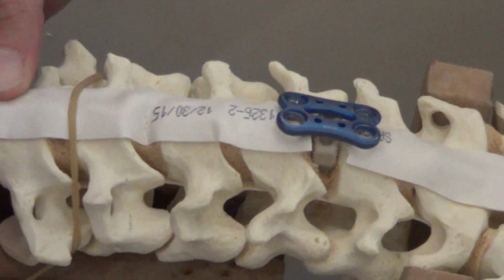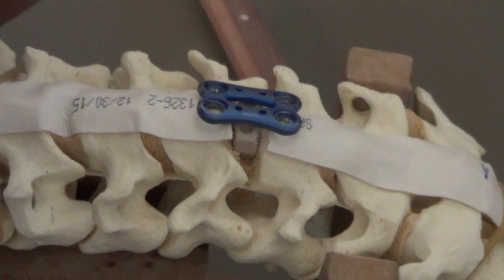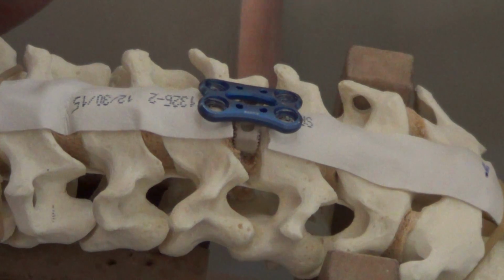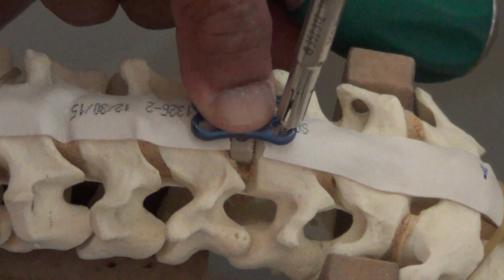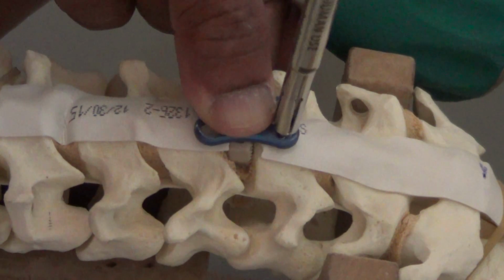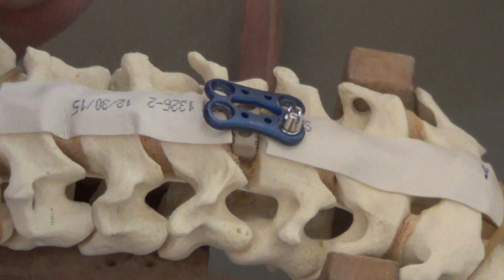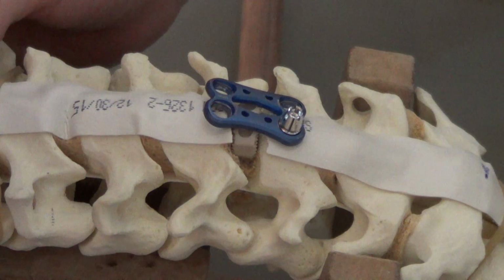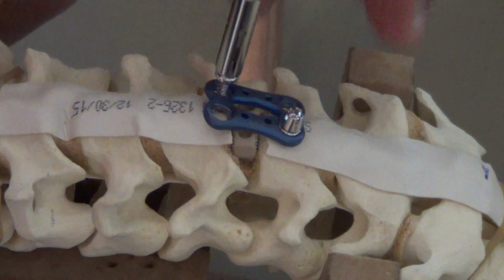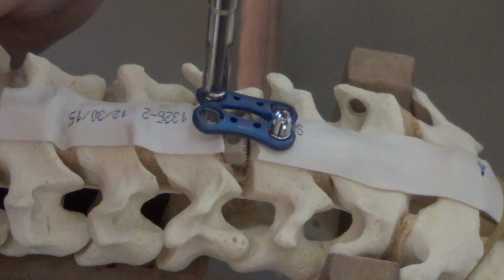Now, this is how you put this plate. Usually the instrument vendors will bring different sizes of plate. So once you have placed the plate there, initially you use a stabilizing pin. So you stabilize this like that. You put one pin above and one pin below. Remember, you have already taken out your distraction pin. Now you put this stabilizing pin.